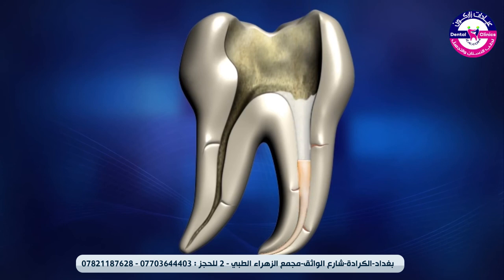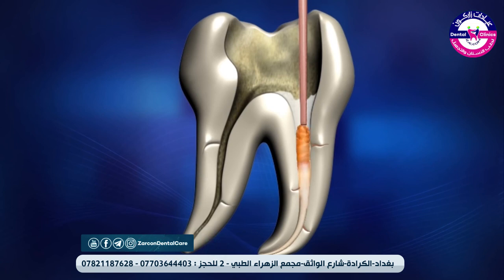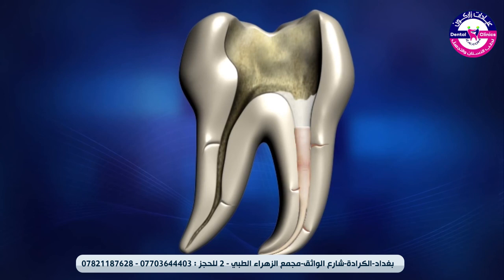Repeat the backfilling process using Dia Gun's heated tip to make contact with the upper part of the previously extruded gutta percha obturator. Wait for 3 to 5 seconds, allowing the tip to reheat the material. Begin extruding the melted gutta percha obturator 2 to 3 millimeters away. Slowly remove Dia Gun's tip. Use the hand plugger again to pack down the melted gutta percha obturator. Repeat this process until the canal is filled completely to the orifice level.